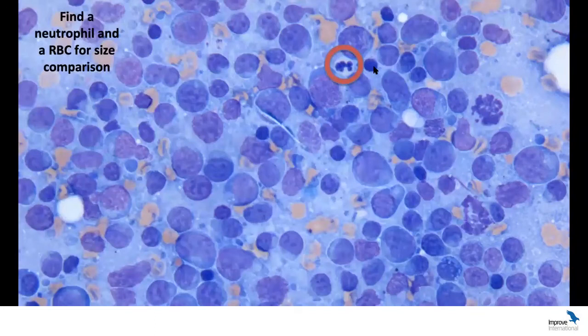So that's my normal small lymphocyte. Remember that we then use the red blood cells to classify the nuclei of these cells, and for classifying them as large lymphoid cells, we usually say 3 times the red blood cell in size for that nucleus. So the majority of them here are actually large lymphoid cells.